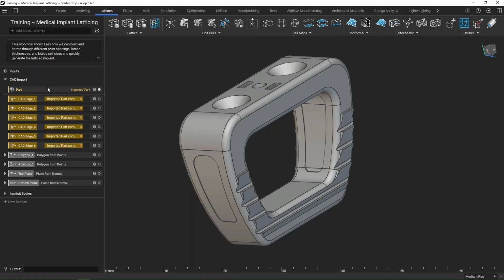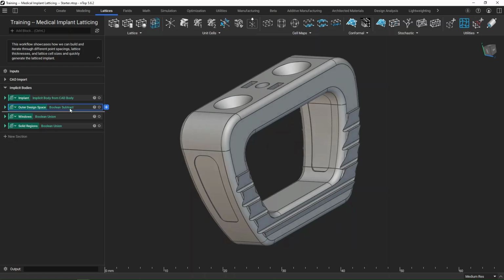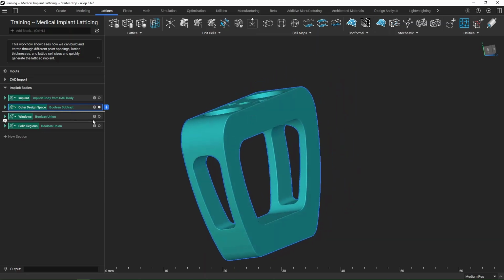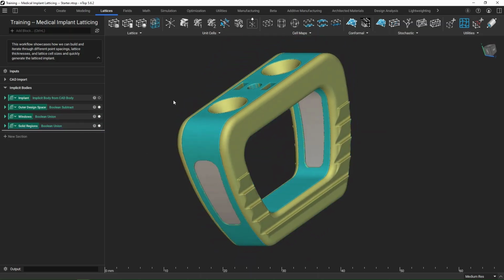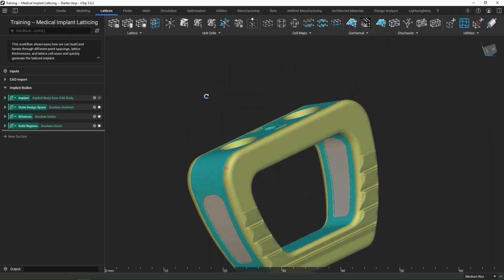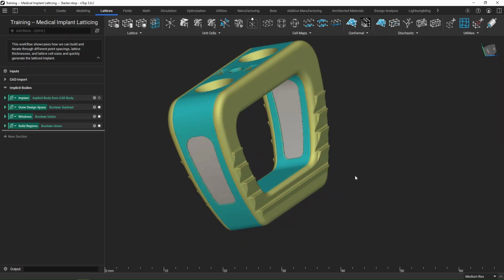I've done some extra work to isolate some edges and regions so that we can actually define a couple more areas within our geometry. So by clicking on these, hitting I to isolate those views, we can see I've got that outer design space. I have our 2 windows, and then I also have solid regions that we want to keep and not touch because perhaps we want to keep these nice features here. Have to keep this solid because maybe those are going to be where we're adding in some threads, things like that. But yeah, we have our 3 different regions. We'll use all of them by the end here.